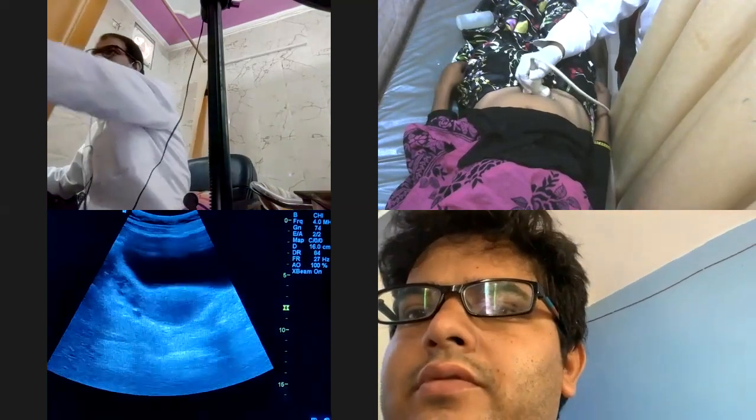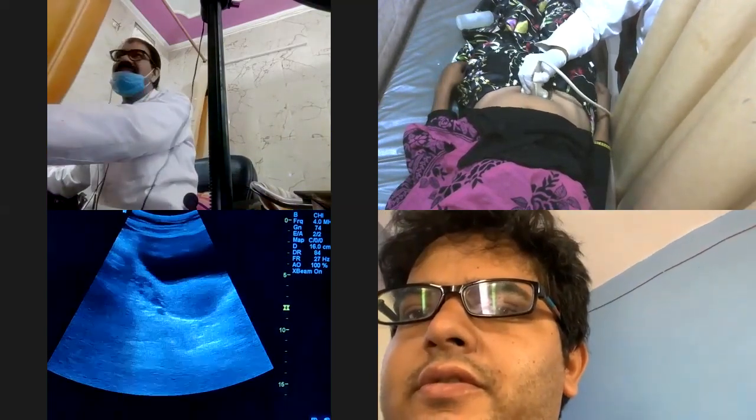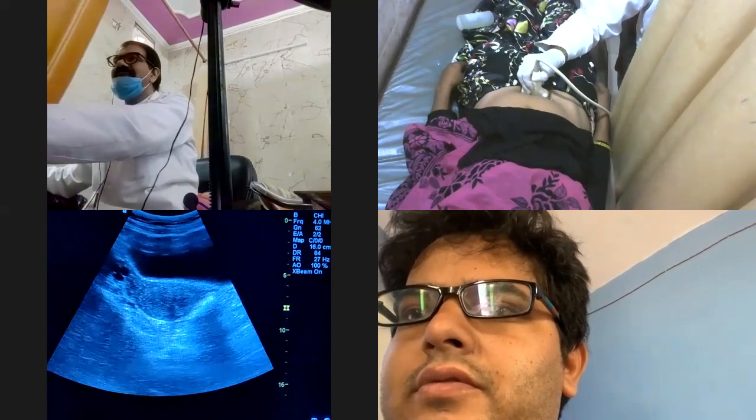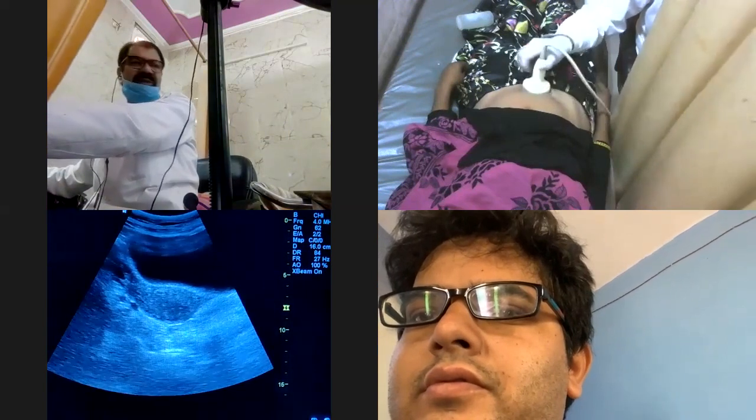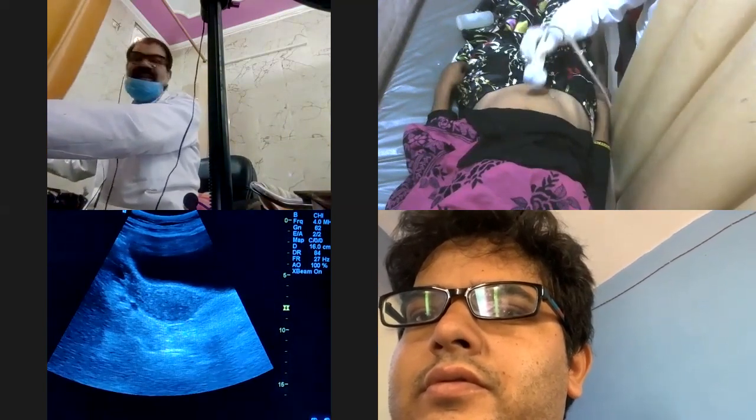Are you getting the point? Yes sir. What will decide the probe position, whether I have to put it this way or the other way?